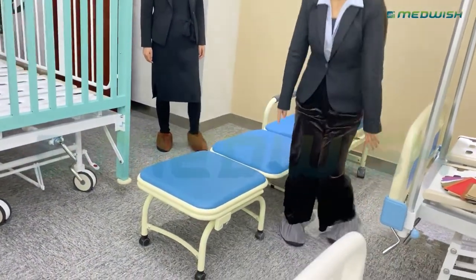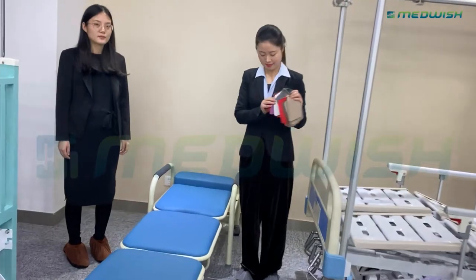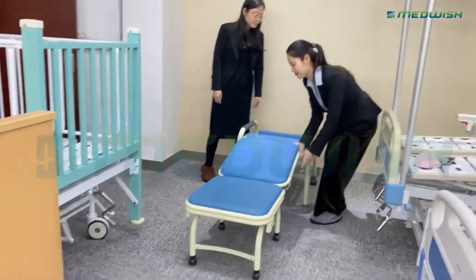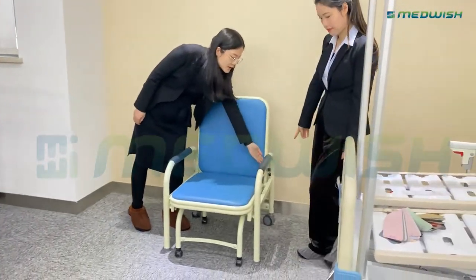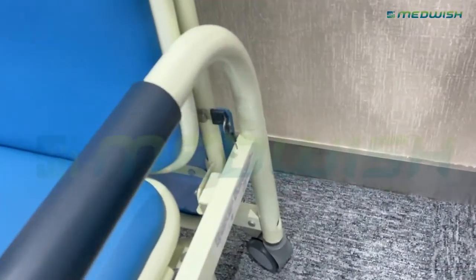We also have OEM color options for your preference. And we also have an OEM locking position — we can provide an OEM key to lock the chair.